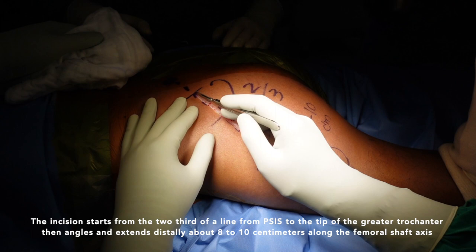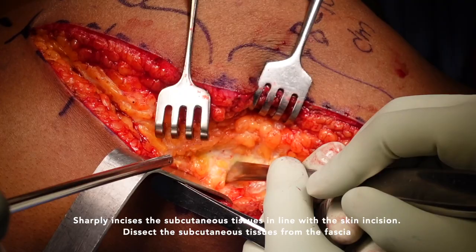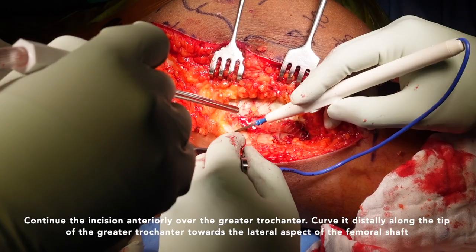Sharply incise the subcutaneous tissues in line with the skin incision. Dissect the subcutaneous tissues from the fascia. Continue the incision anteriorly over the greater trochanter. Curve it distally along the tip of the greater trochanter towards the lateral aspect of the femoral shaft.